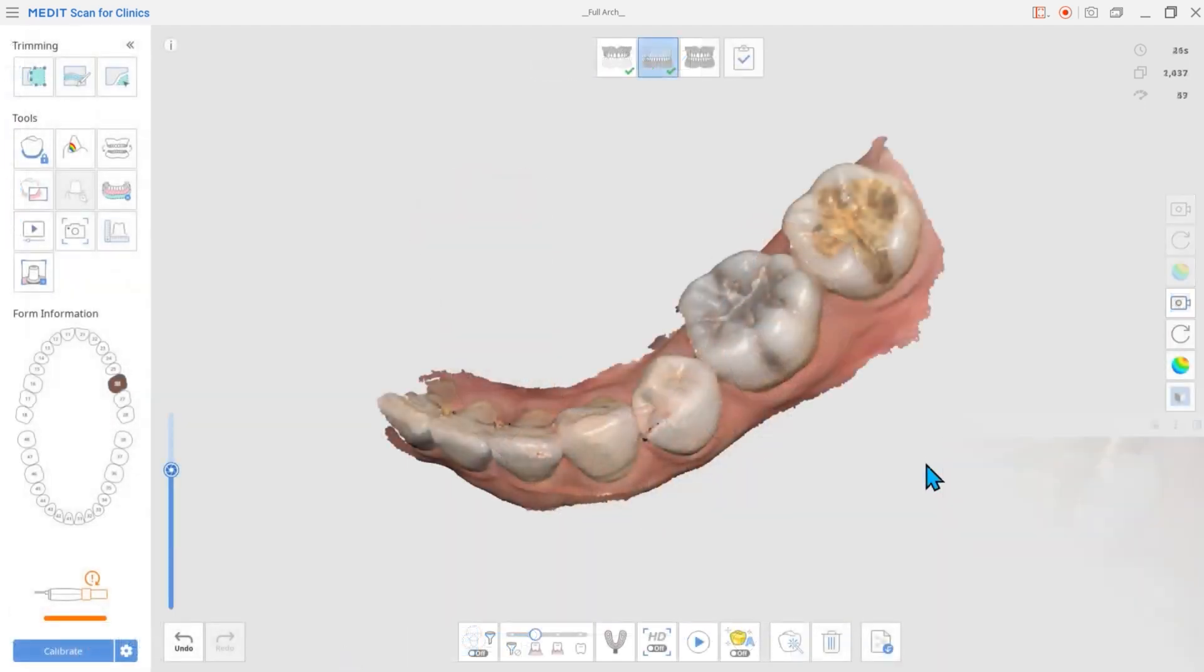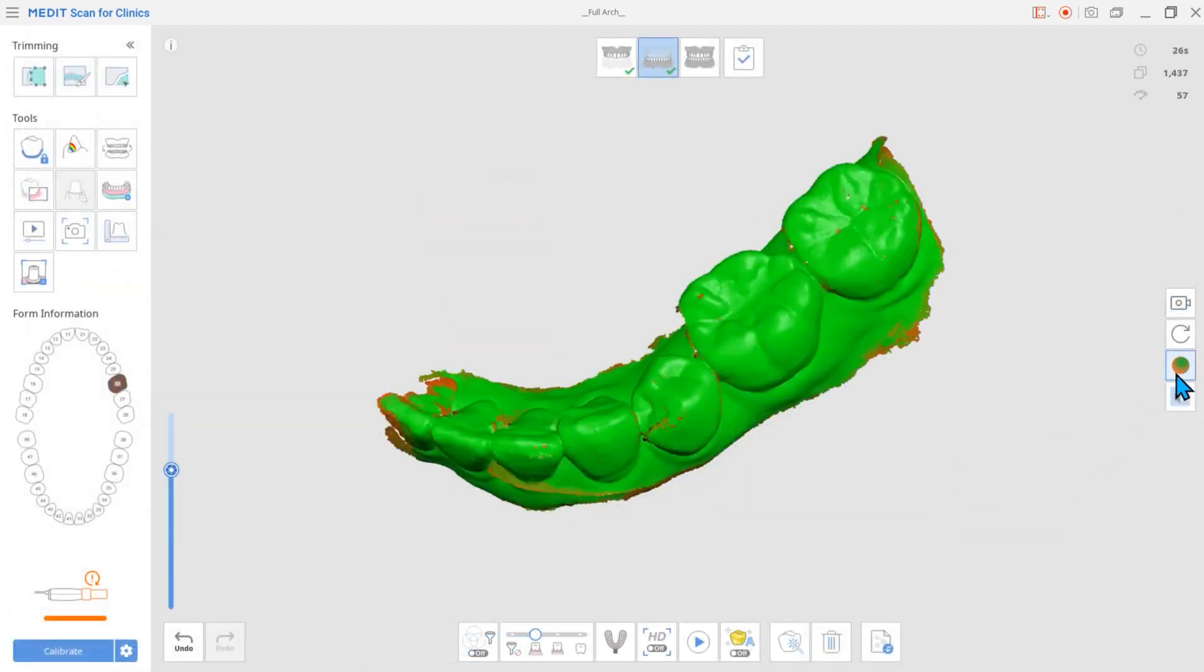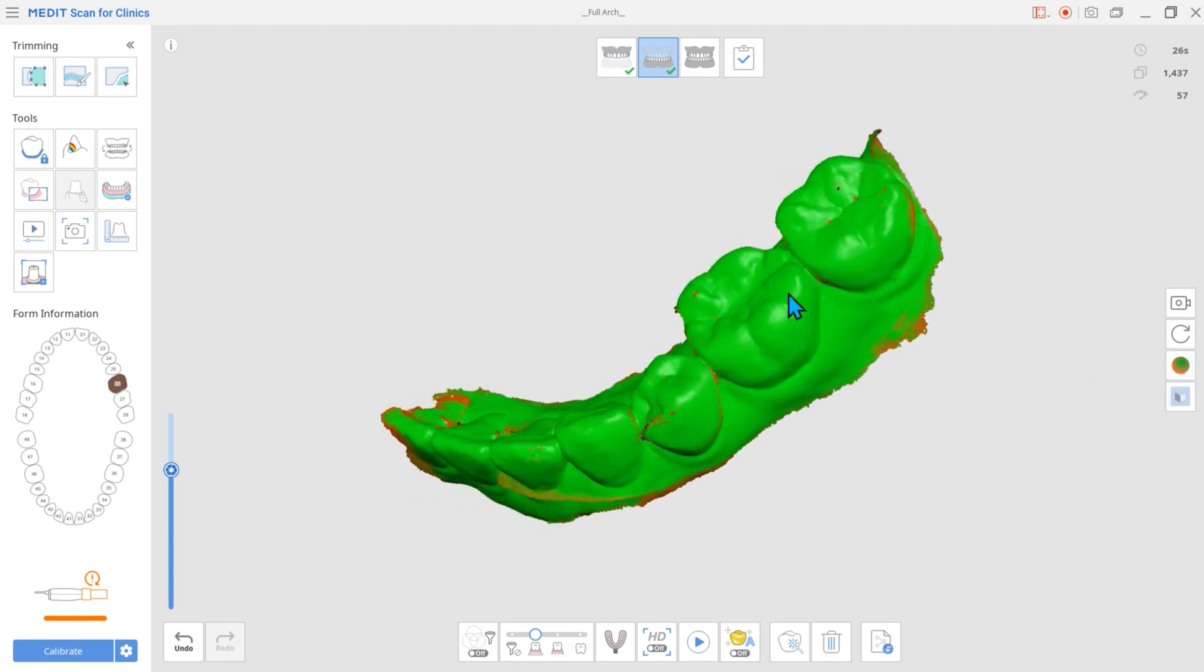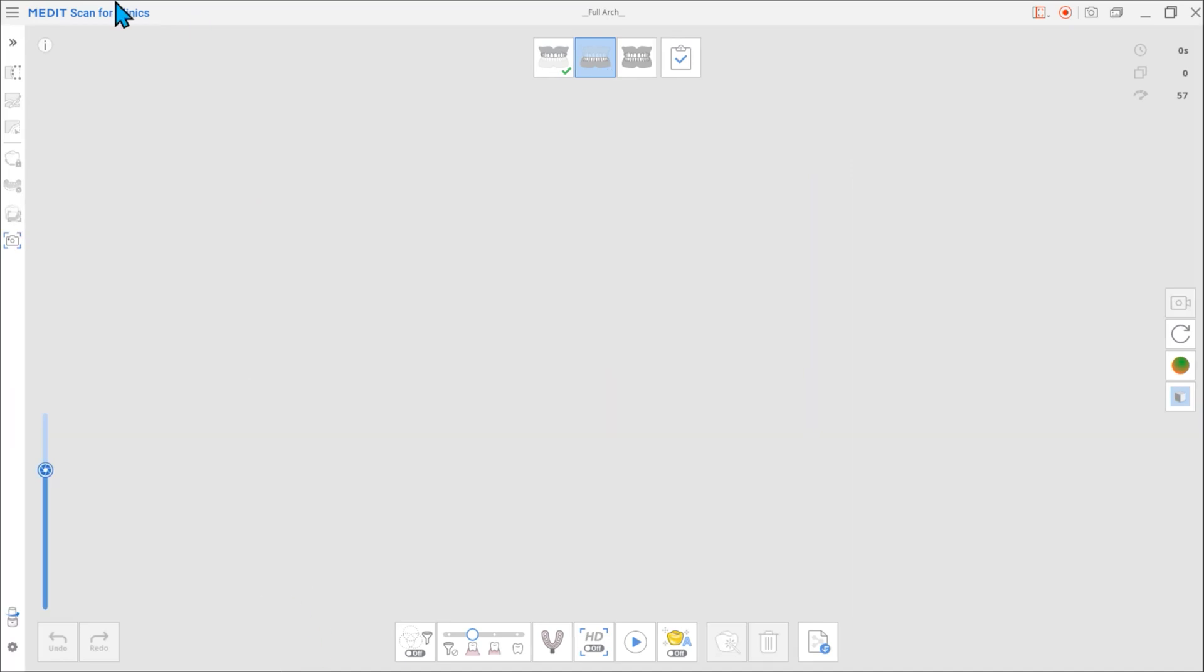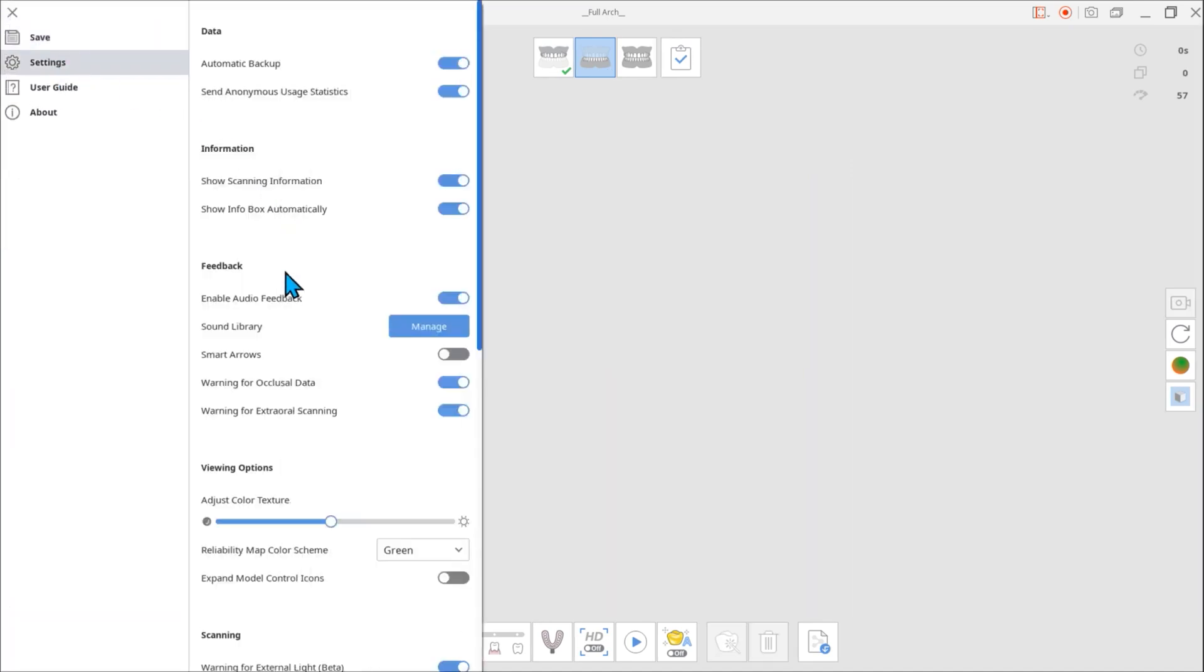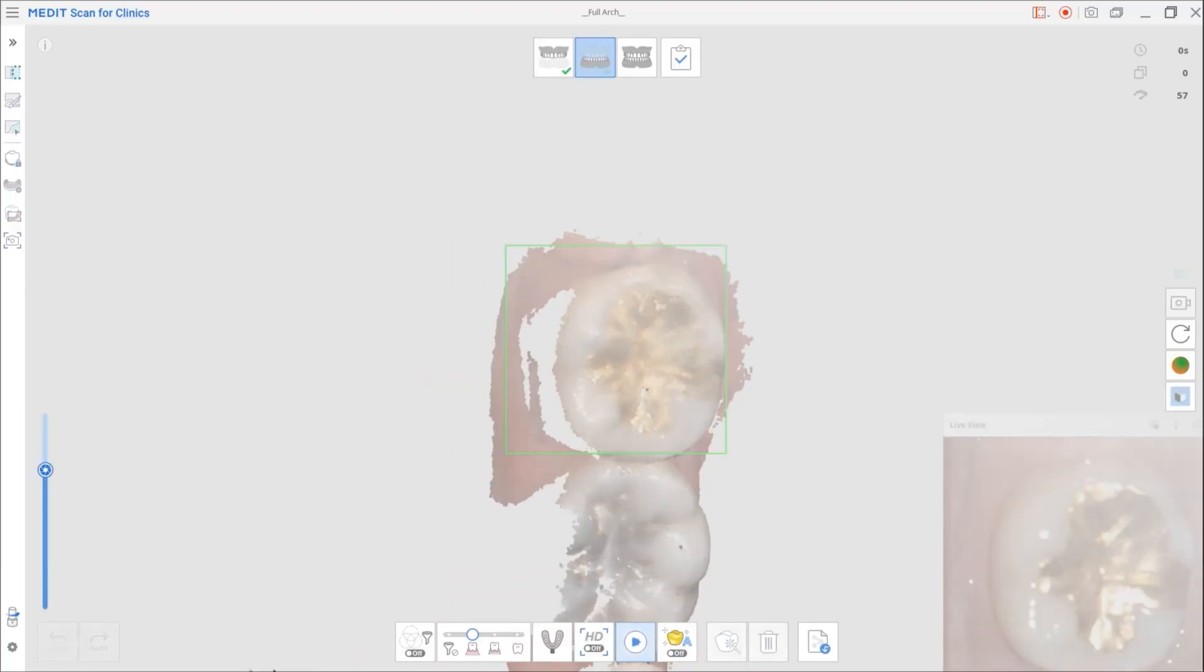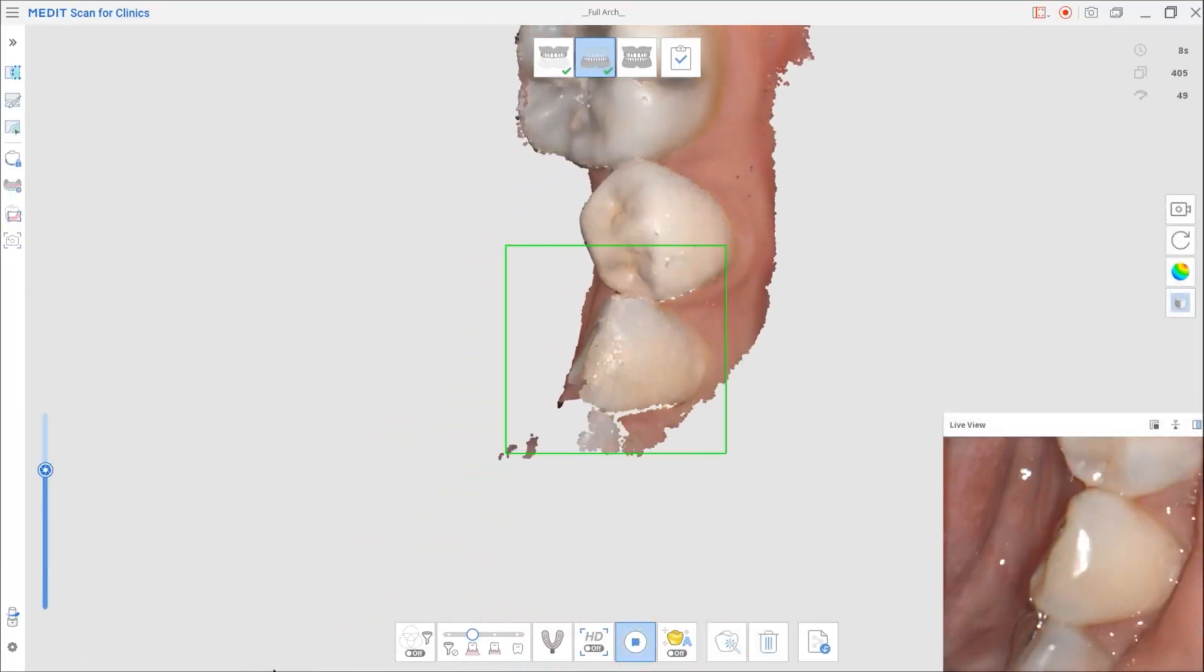Another addition is the Smart Arrows feature. Previously, you could only check the reliability of the data by changing to the reliability map. With the update, the Smart Arrows will automatically show you the areas with low reliability when you stop scanning.